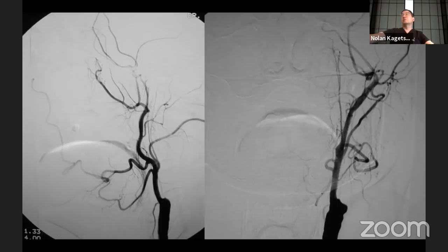And then the last two branches are the superficial temporal. This is the end of the external carotid artery, and then this is the superficial temporal artery, and it has a little wiggle here anteriorly and keeps going up. You can follow it on this image. One of the ways you can tell it's superficial temporal is that on some of these images, it's external to the skull. And this one is going to head off and be external to the skull.